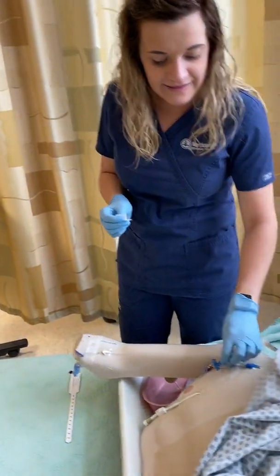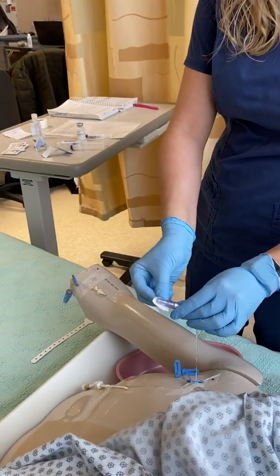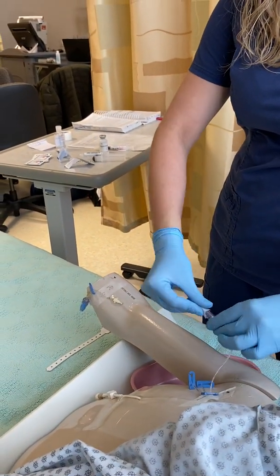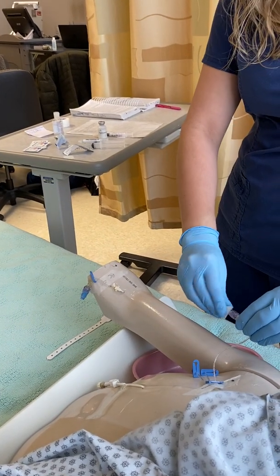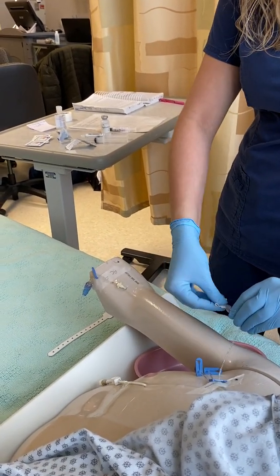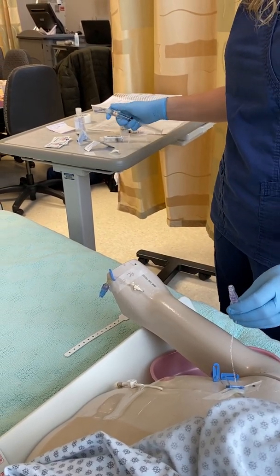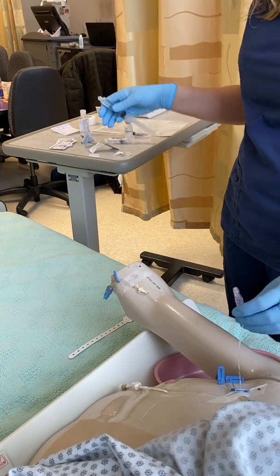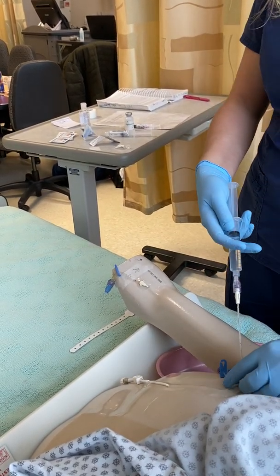I'm going to go ahead and clean the access device. And you want to make sure you have selected the right line, not giving it in a TPN line. So I know this is not the TPN line. So the first thing I'm going to do is go ahead and flush. I'm going to attach that, and you wait for this to dry.